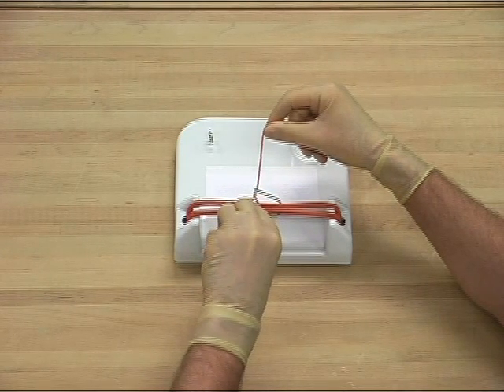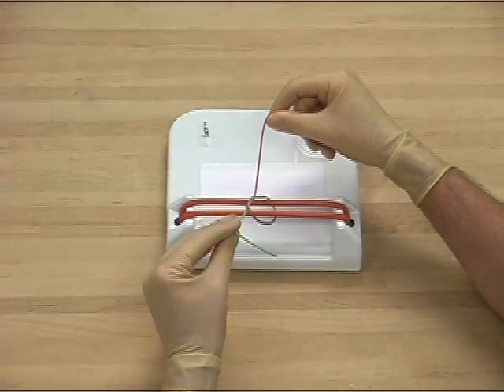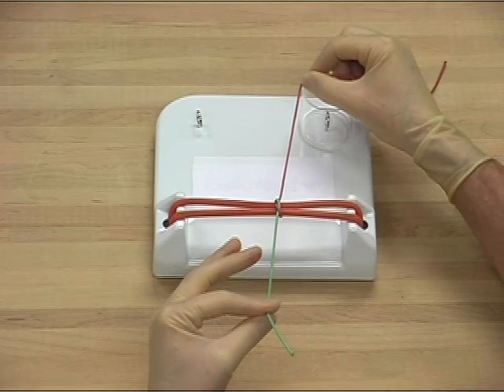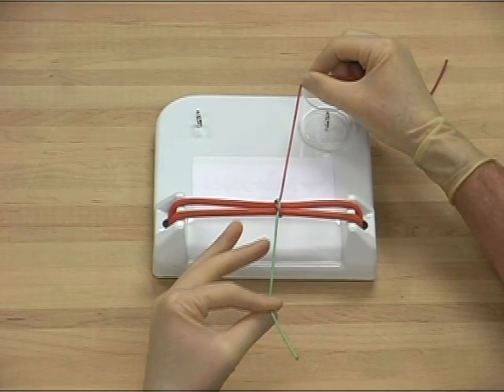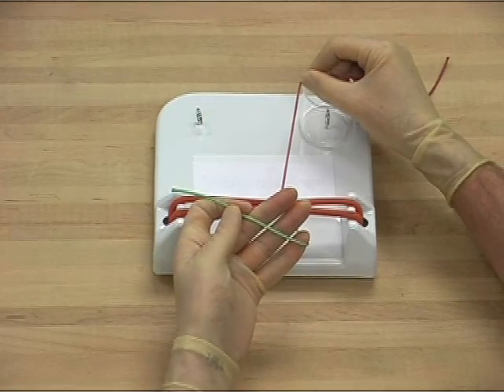This manoeuvre requires purposeful wrist rotation. The free end is then pulled towards the surgeon. The fingers are then placed on top of the suture. The hand is supinated, placed palm up.